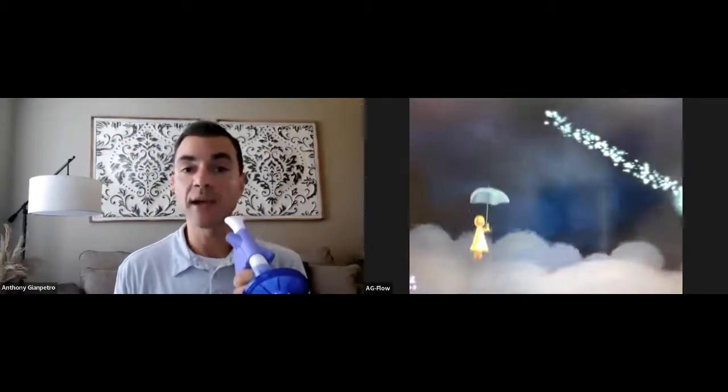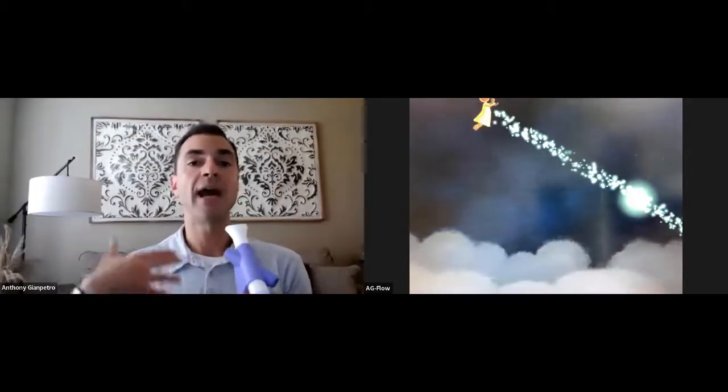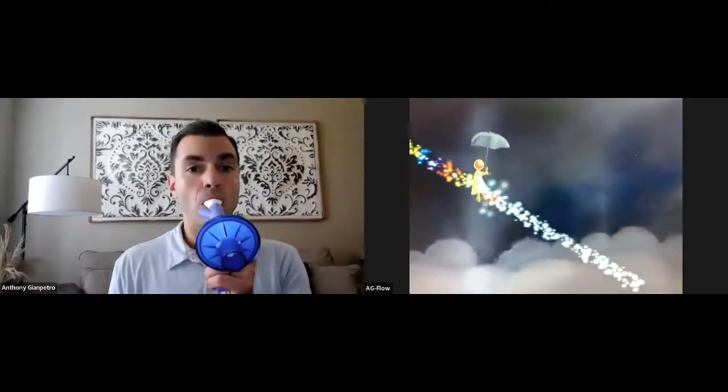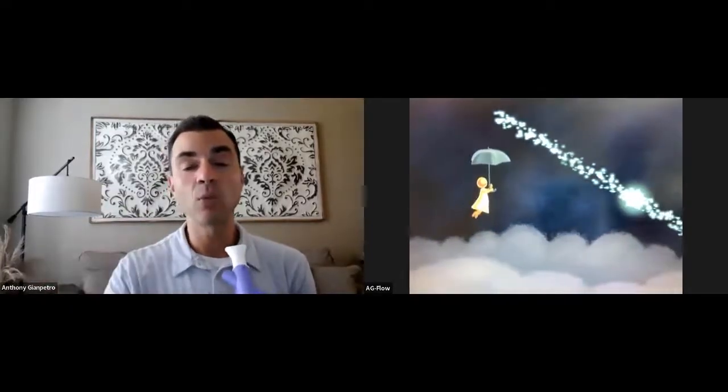So that was about 6 seconds right there. And the device is naturally taking the avatar back up. Once I feel ready, I can continue with just the exhale. And you'll notice the path is a lot skinnier, which makes it harder to stick with. That was another parameter that I adjusted in the last screen.